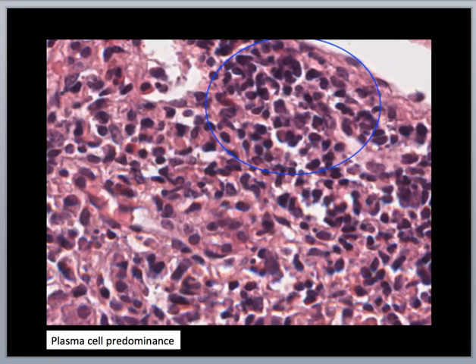And the blue circle highlights numerous plasma cells that are touching each other. This is the highest magnification that I can get, but you can appreciate that some of the cells anyway show the characteristic eccentric condensed nucleus and abundant amphophilic or purplish cytoplasm.